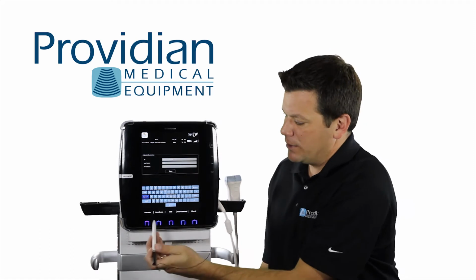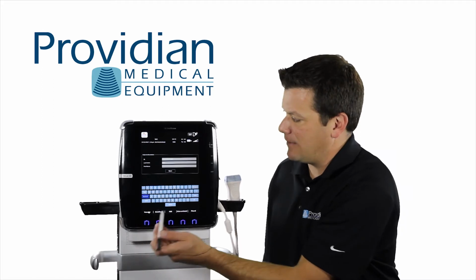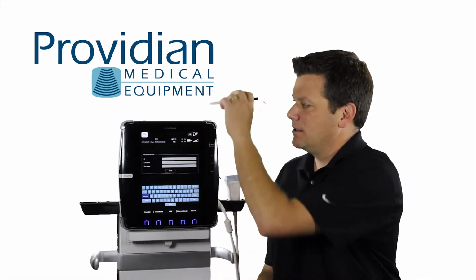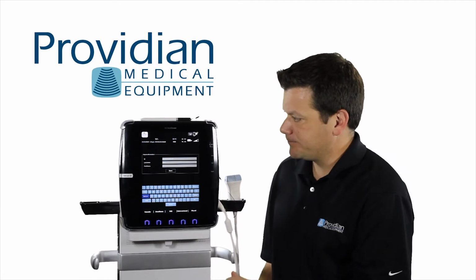Next, we select which application we're going to do. Pleural, interventional, MSK, anesthesia, and vascular. These are all underneath this MSK setting, which I started in the beginning where it booted up to the MSK. We can change that as well.